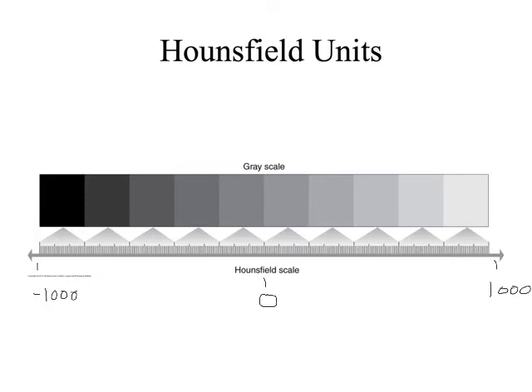Right? That's important because what that means is that there's information about the attenuation hidden in the images that my eye can't see. There's information that's hidden in the images my eye can't see. So what do we do with that? Well, we're going to play with it some.